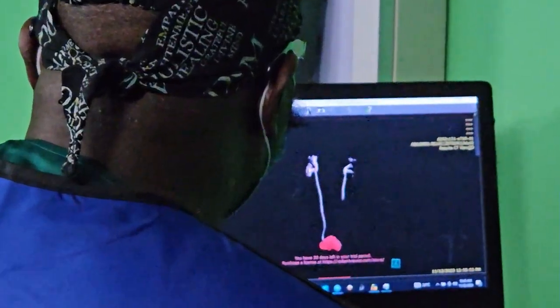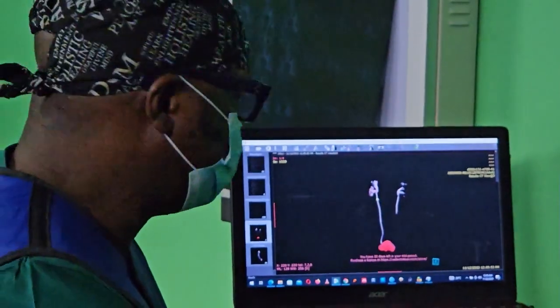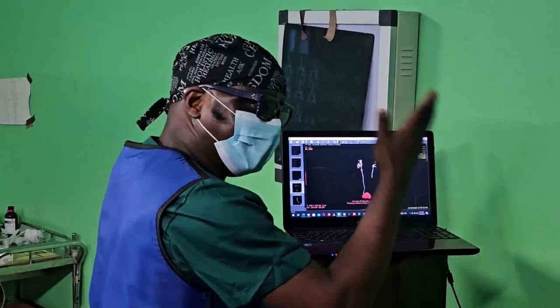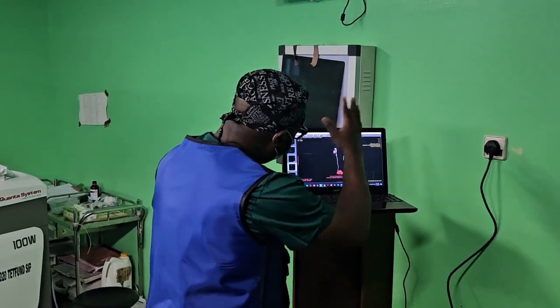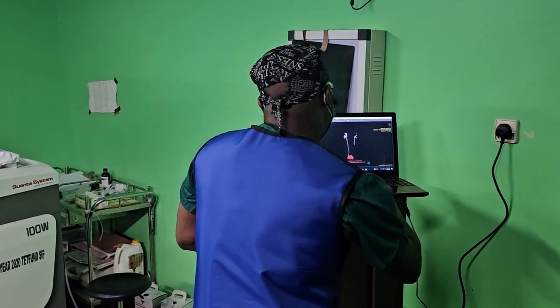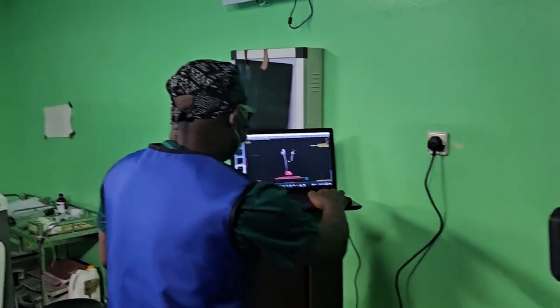The middle pole puncture will give us access to the bulk of the stone, access to the PUJ. Should we have any fragment going down the ureter, we can actually chase it, if we have the full armamentarium and skill set for retrograde access. So Dr. Lawa can help me flush any fragment that is below, flush them up, and I will just retrieve them through my Amplatz sheet.